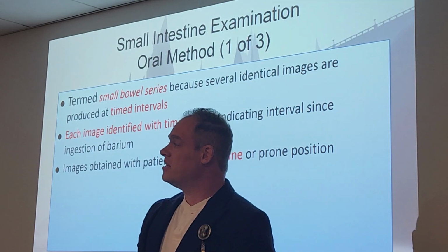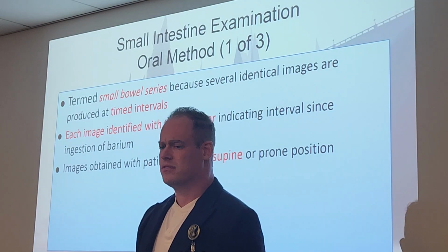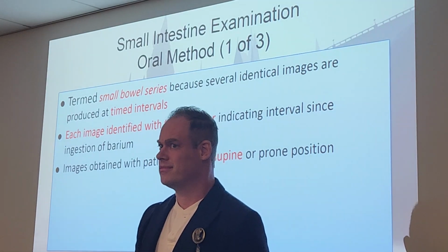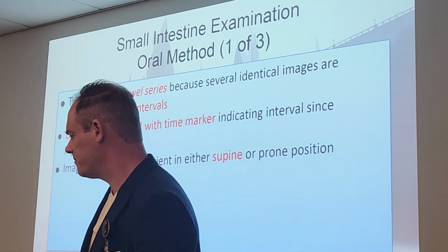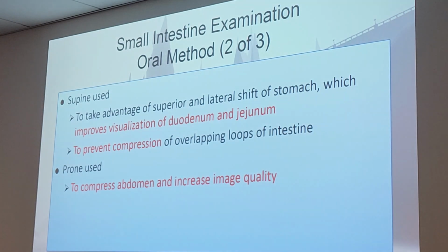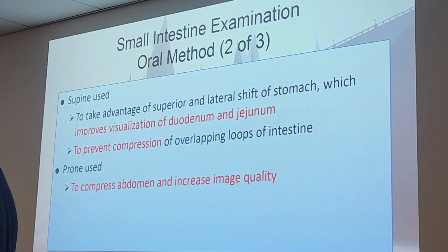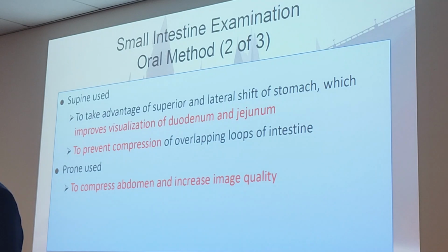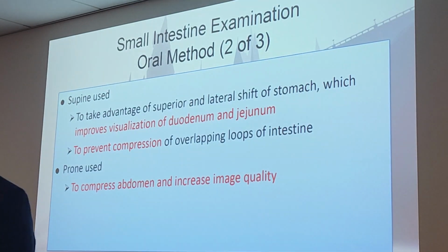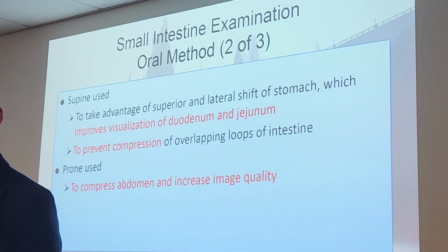Okay, for these images, they'll be either supine or prone, but preferably supine. You're typically not going to see it done prone. I don't think I've ever done a prone small bowel film, at least to my memory. It should be supine. When we do supine, that's going to improve the visualization of the duodenum and jejunum. We do look at jejunum, ileum, duodenum, all three parts. And it's going to prevent compression of the loops of the intestine. It's going to spread them out a little further and give a better view. Prone, if we do want to compress the abdomen and increase image quality, we can opt to do so, but supine is considered the more optimal view too.